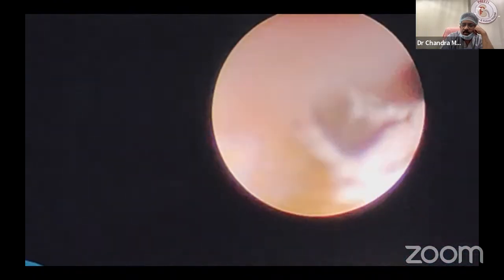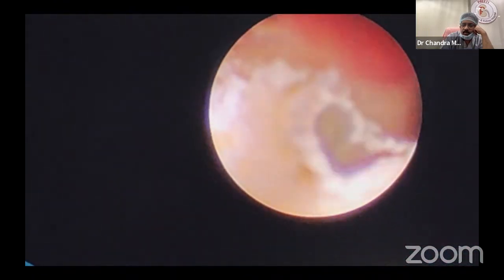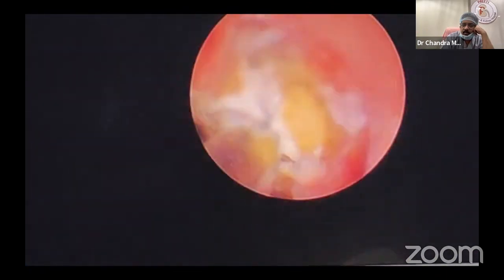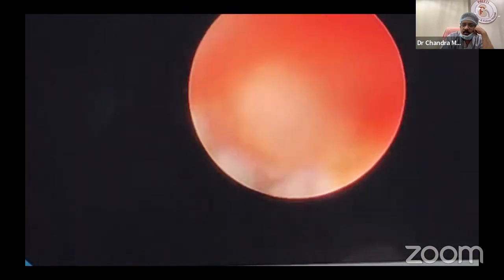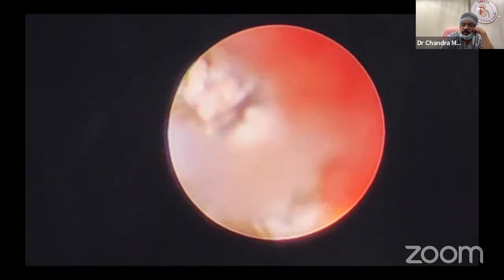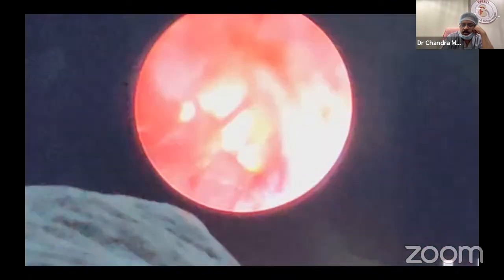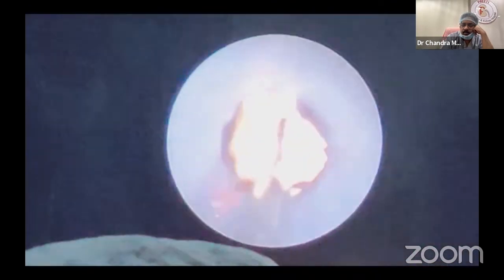We can break through the hole. See, it is broken because it is weakened. You got the point? Now I can take this out, and see, it is broken and coming out in total.